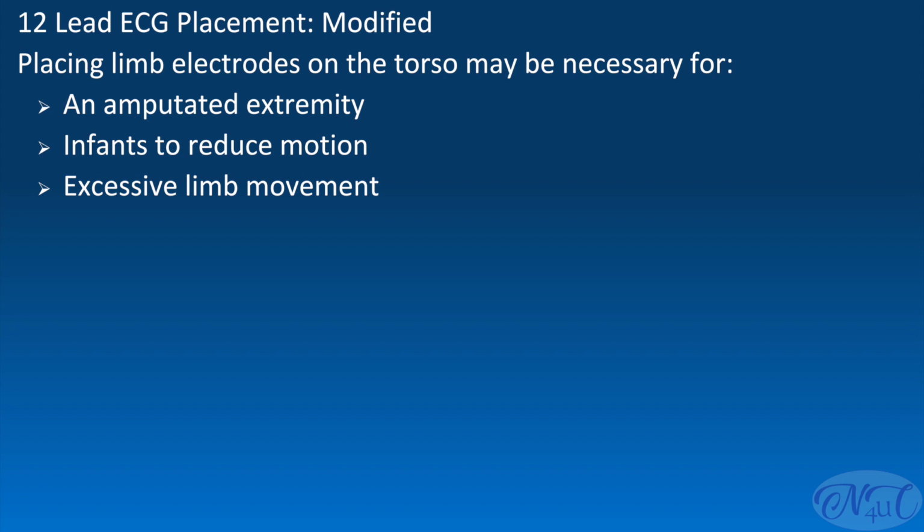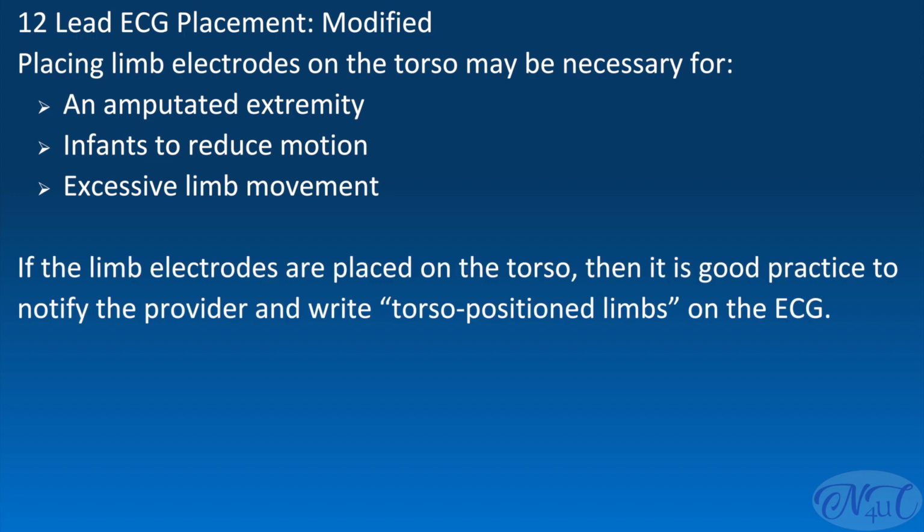It is important to note studies have suggested potentially significant changes to the ECG morphology when the limb electrodes are placed on the torso. As a result, if the limb electrodes are placed on the torso, then it is good practice to notify the provider and write torso positioned limbs on the ECG.